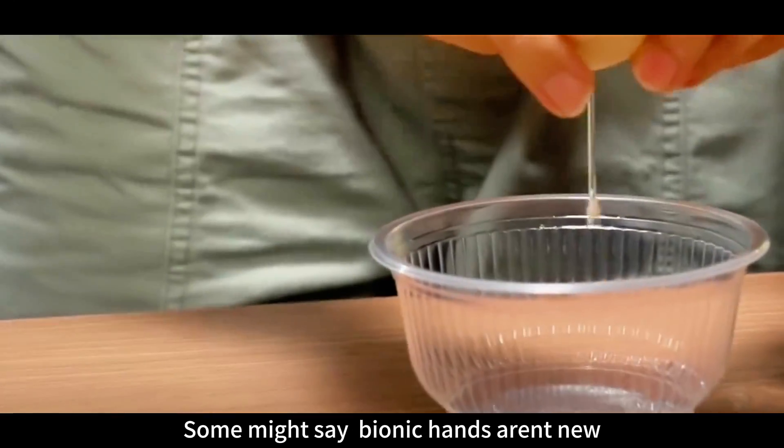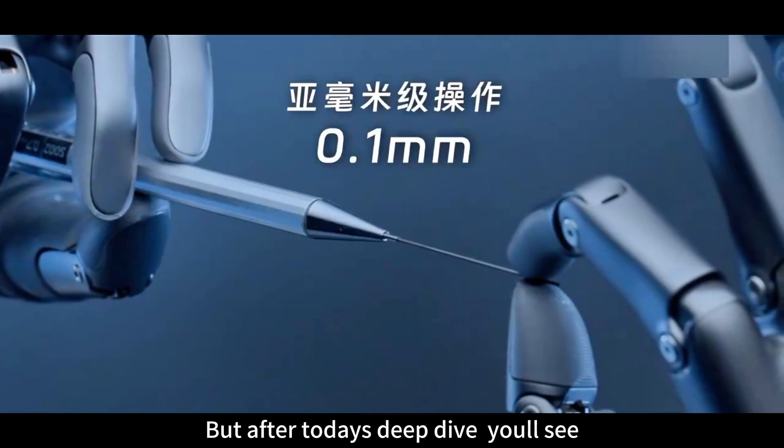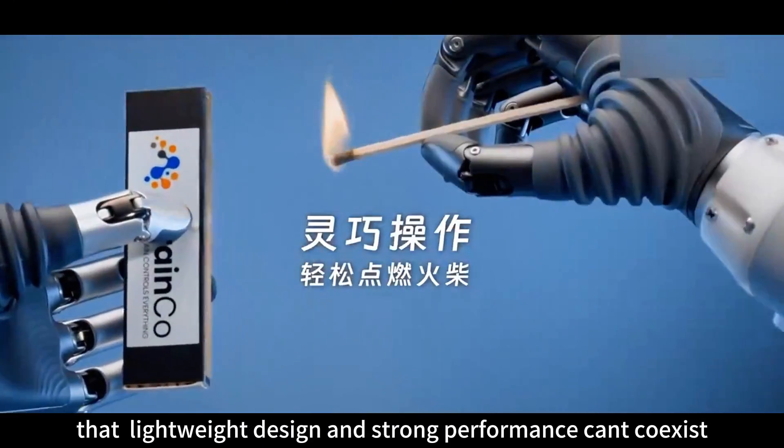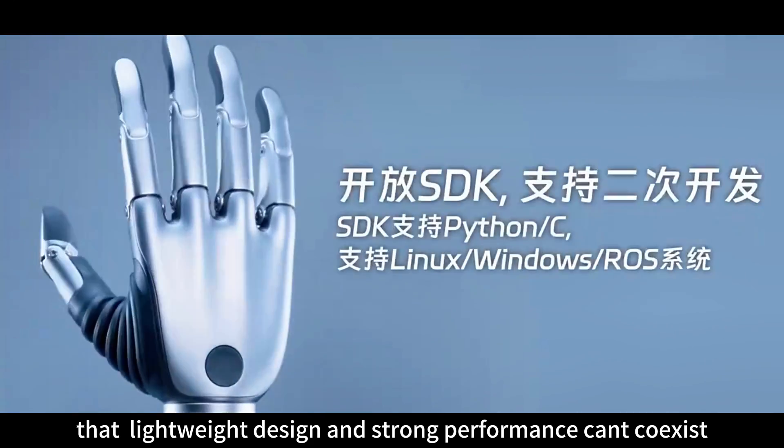Some might say bionic hands aren't new. But after today's deep dive, you'll see it's broken the industry's so-called rule that lightweight design and strong performance can't coexist.